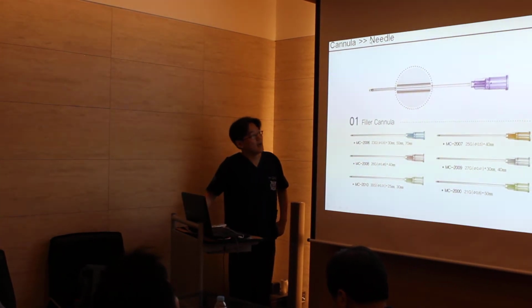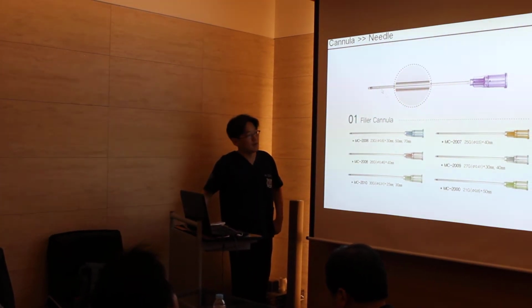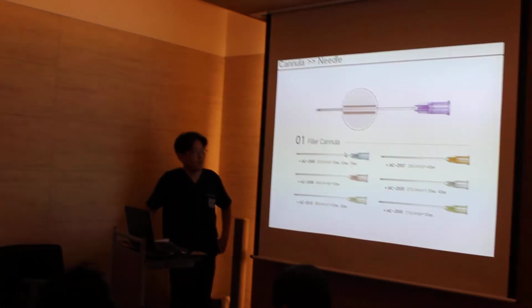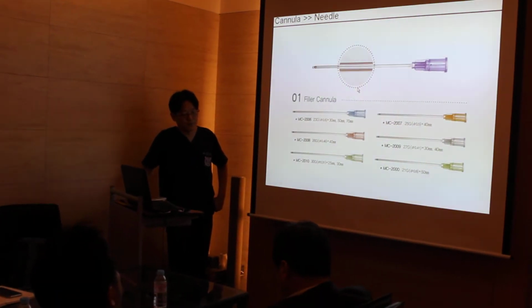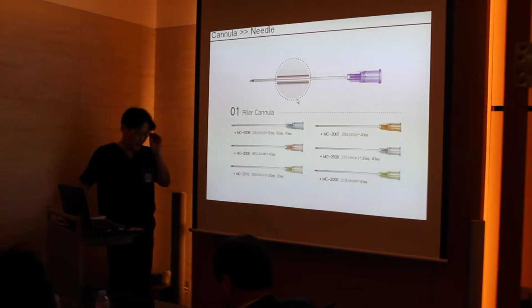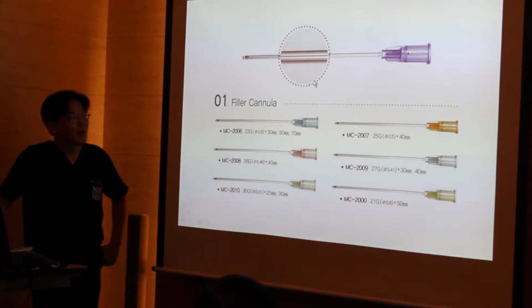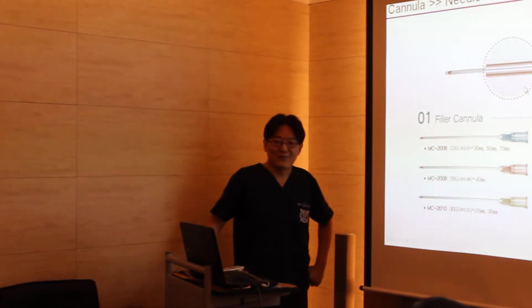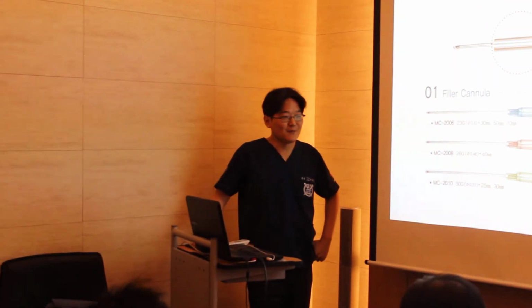But I think generally I usually prefer cannula, because vascular accidents make very dreadful results. So you should be careful before you do the procedure with filler. I have many experiences, but even now I pray before the filler injection, because sometimes it happens.